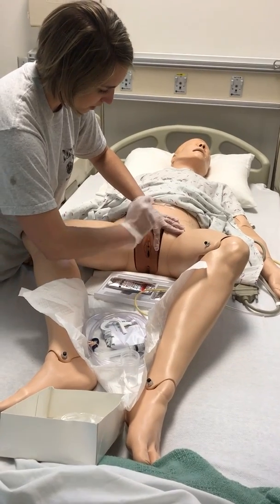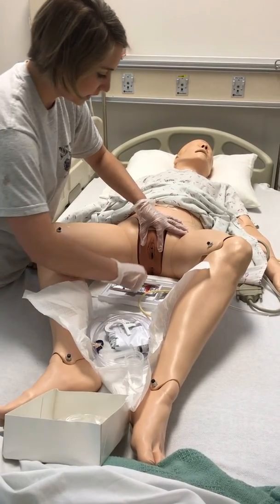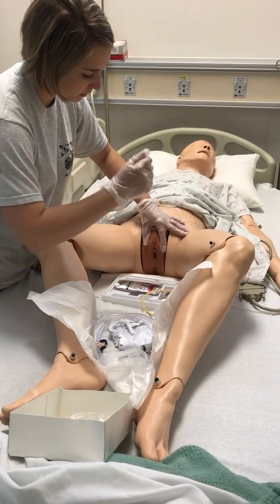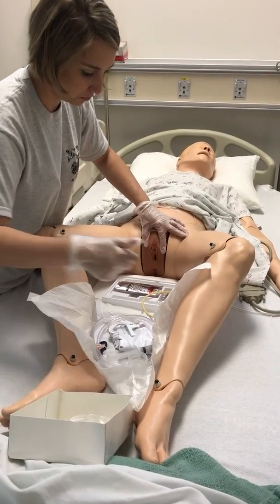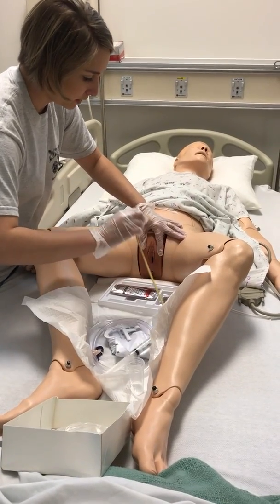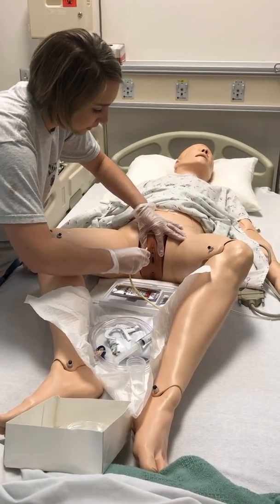Take the first swab and swab the outside, throw it away. Second swab, swab the other side, throw it away. Third swab, swab straight down the middle and throw it away. I'm going to take my catheter out of my loop. Can you take a deep breath for me? And I'm going to begin.